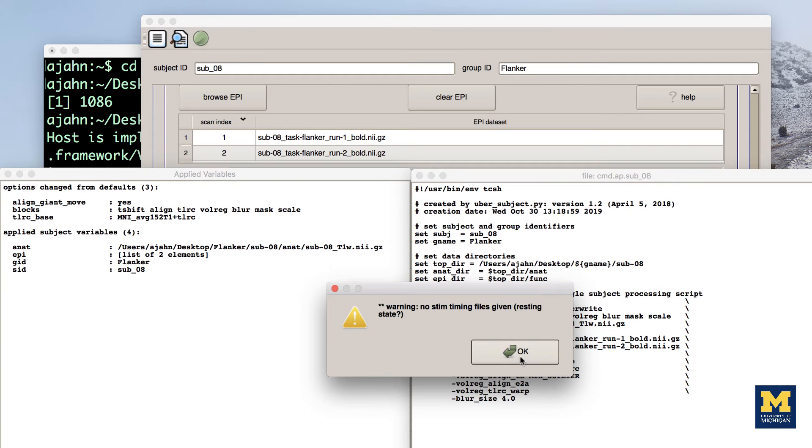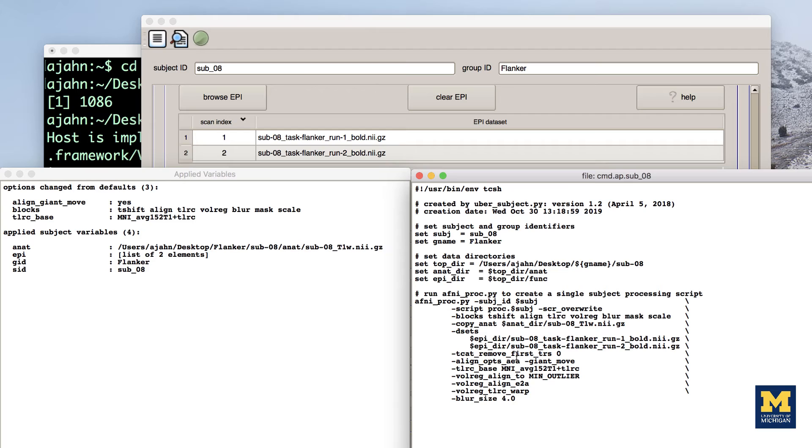It will return two windows, one listing each of the options that were changed from the defaults and listing each of the inputs, and another showing the code of the AFNI PROC PY command.